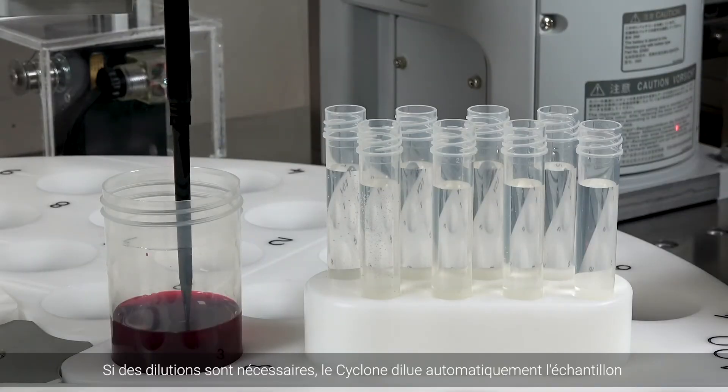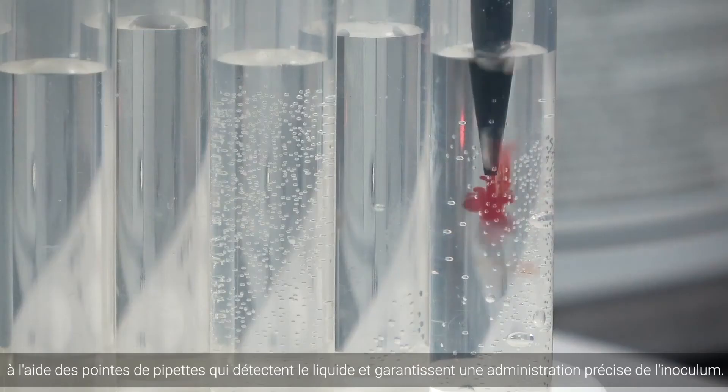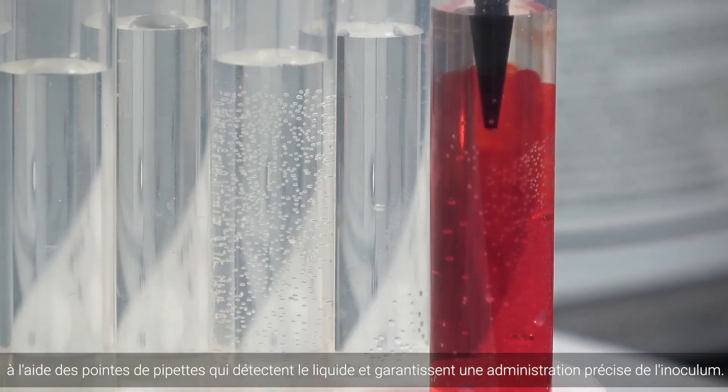If dilutions are required, the Cyclone automatically dilutes the sample using liquid sensing pipette tips that ensure accurate inoculum delivery.